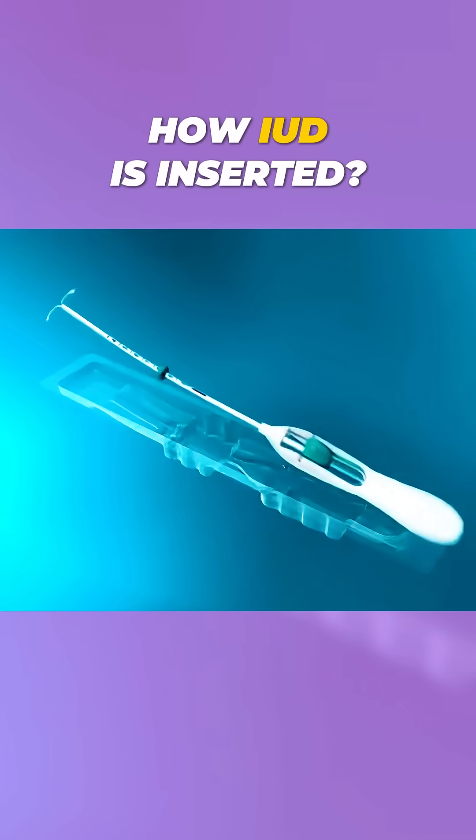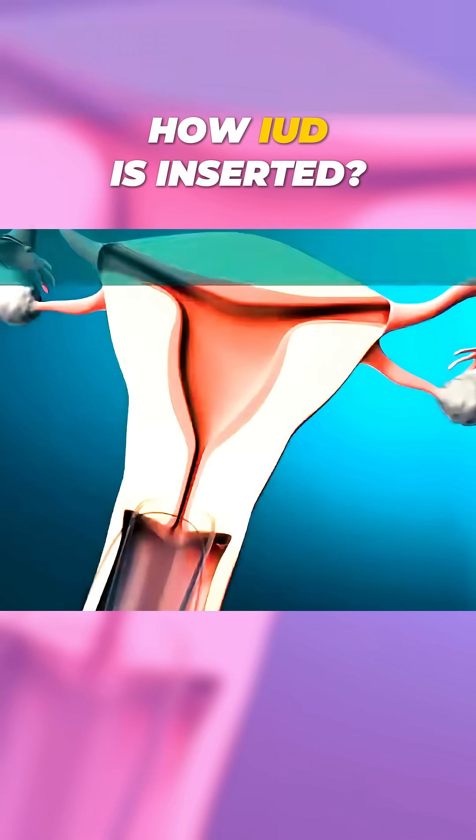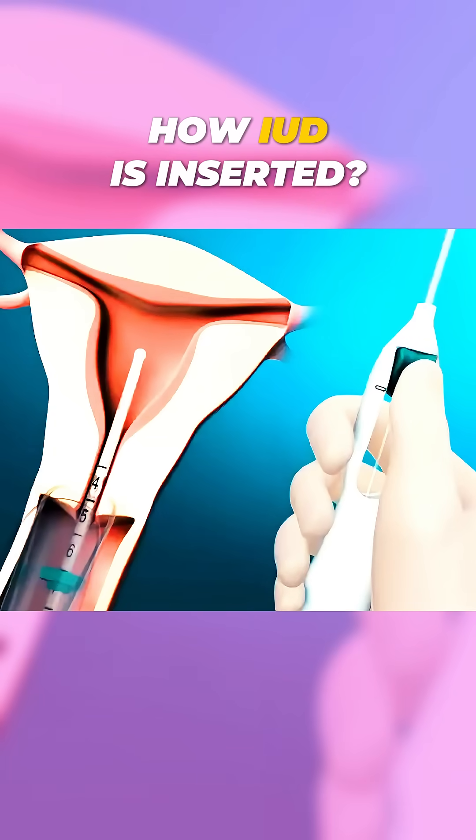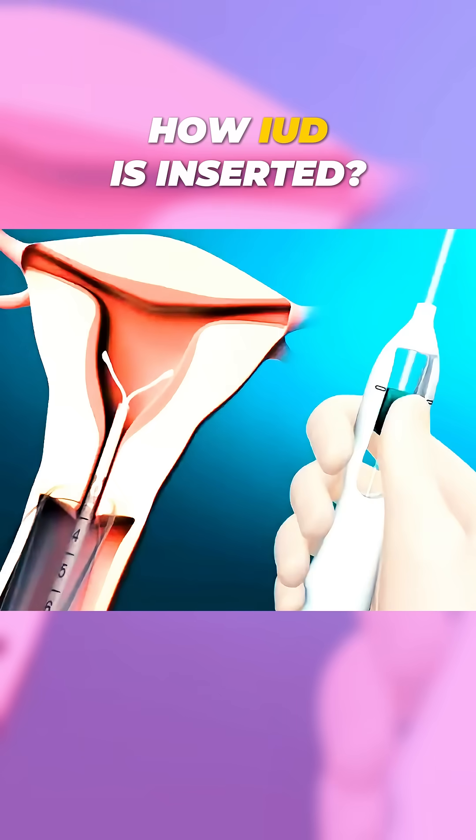The IUD is preloaded into a sterile inserter. The doctor then carefully inserts this device through the cervix into the uterus. Once in place, the IUD is released, and the inserter is gently removed.